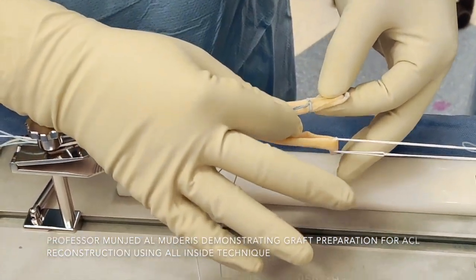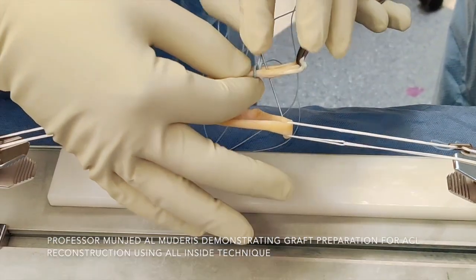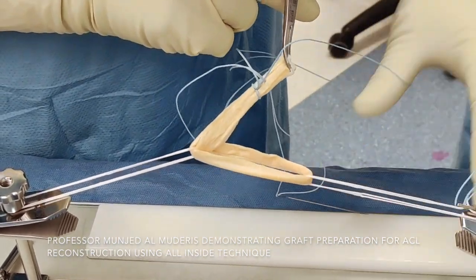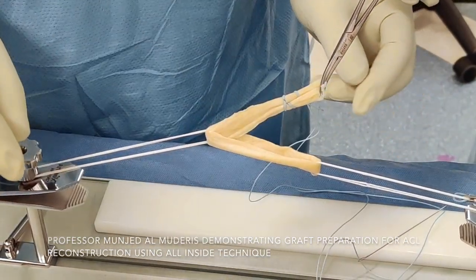I do the internal two passes at the beginning. I pass the suture in the middle, and I proceed from outside in with one go. By doing this, we secure the internal part of the suture together.